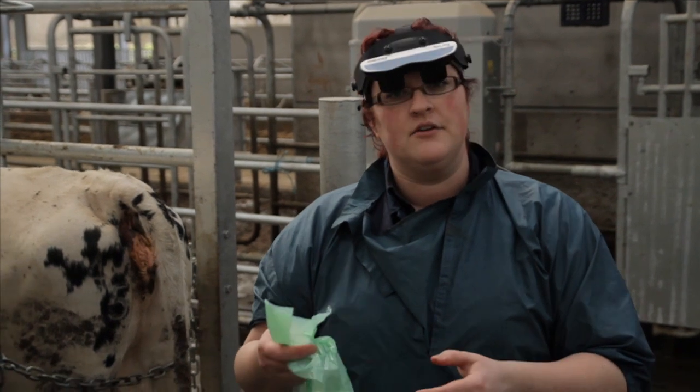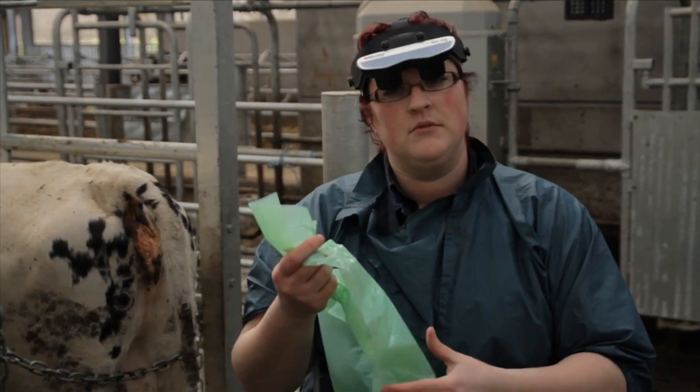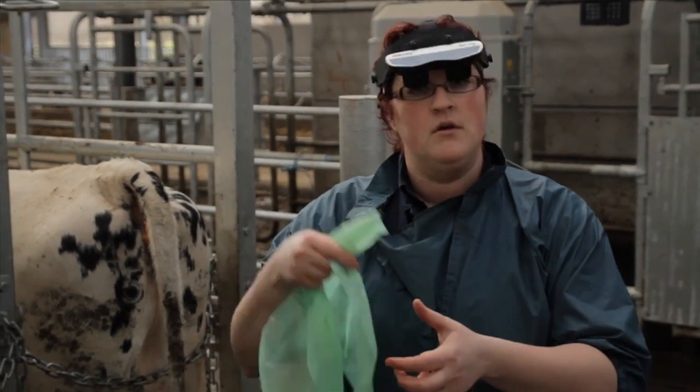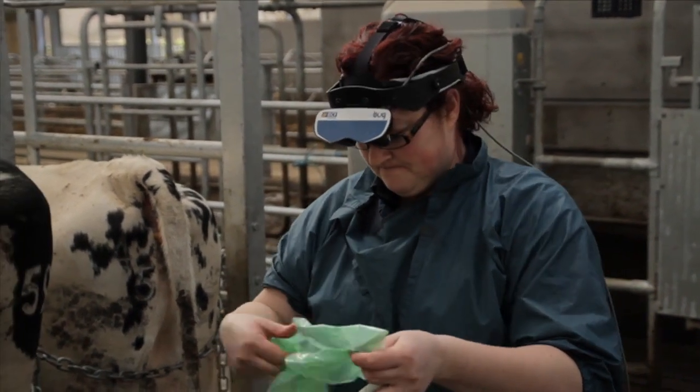Now we're going to look at another cow. You can either use the same glove or use a different glove, depending on the protocols on the farm. We'll use a different glove for this cow.